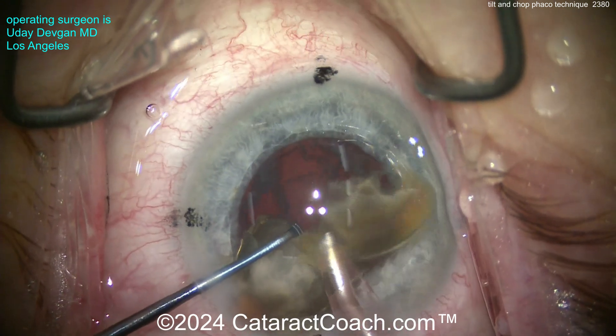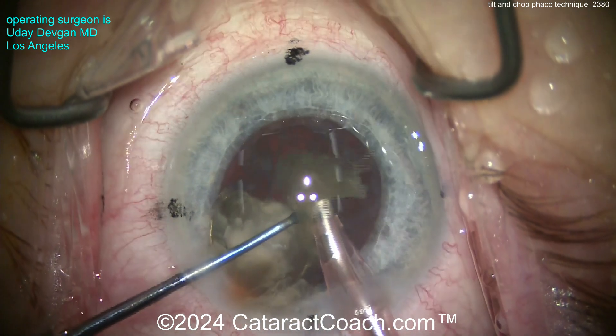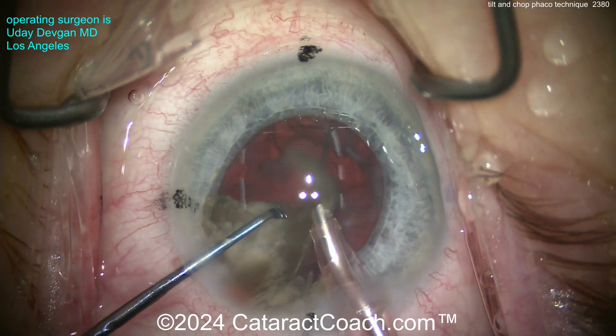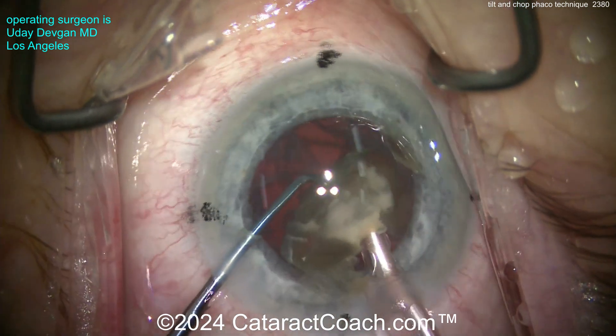We're not riding up against the corneal endothelium — that is key. We've protected the corneal endothelium with a dispersive viscoelastic. Bevel down here, minimize the phaco energy with those power modulations, and the last piece is coming up — the last quadrant.